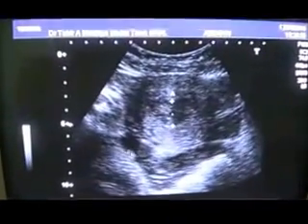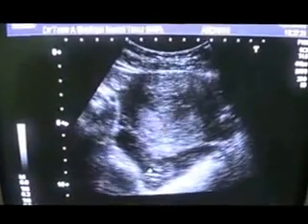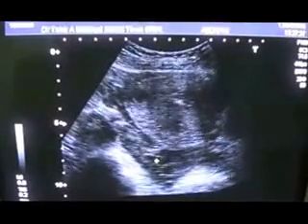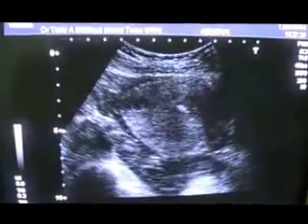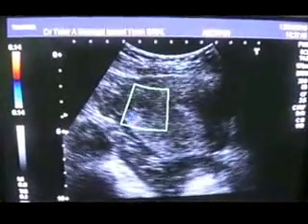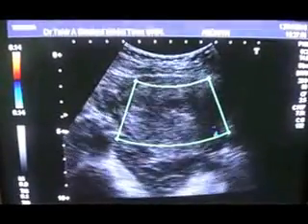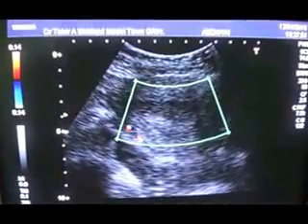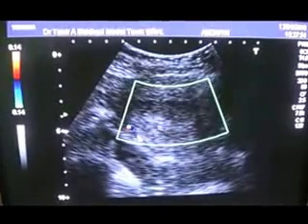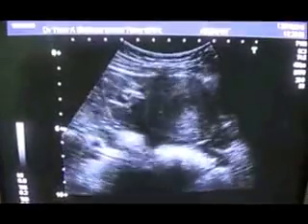This is all fluid posterior to the uterus, and not only that, we see septations within this fluid. These are all septa. Now with Doppler there is no significant vascularity of this dilated endometrial canal filled with different strength internal echoes.